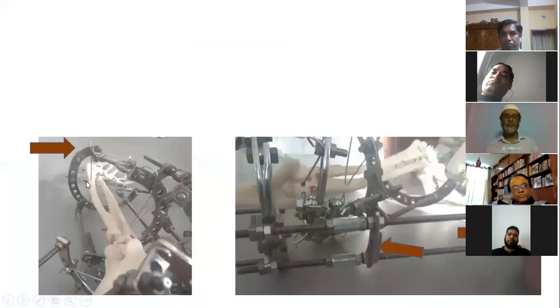And here is the curved plate. You can see a half ring connected with the curved plate to enlarge the size, adjusted with the half ring so that it is connected with the wires, sometimes rods, posts, etc. And here is another curved plate connected with two parallel rods.